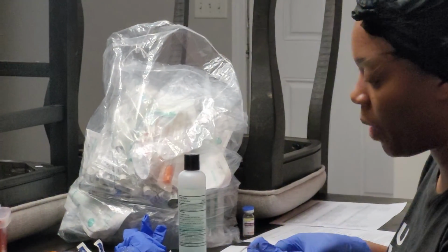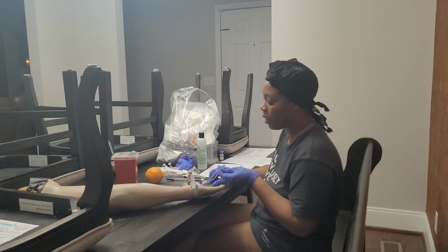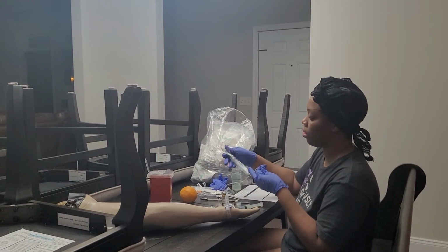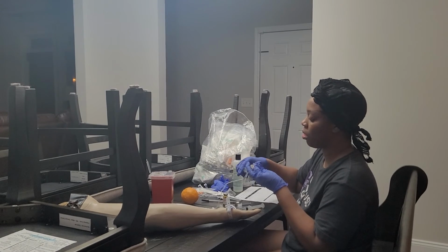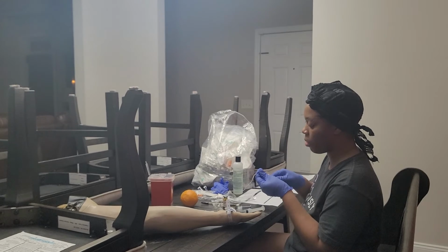So we're all administered. That's approximately 2 minutes. I'm going to flush again with 3 mLs.